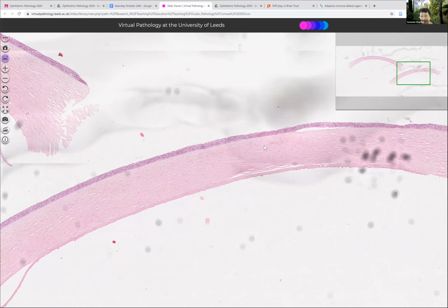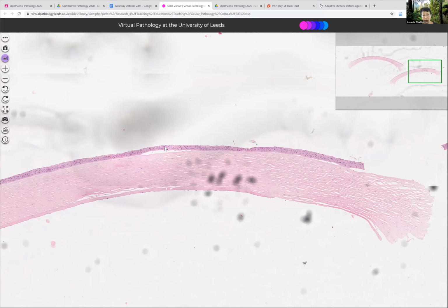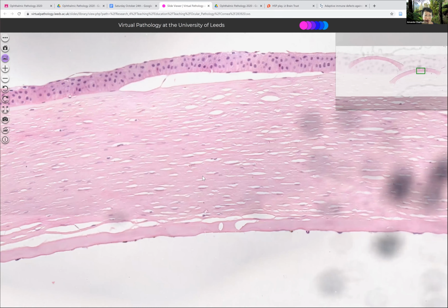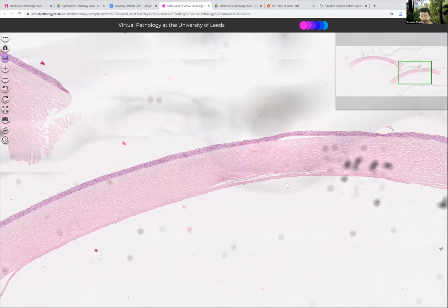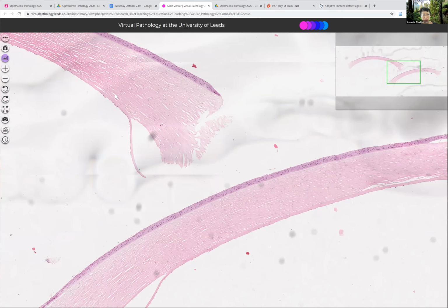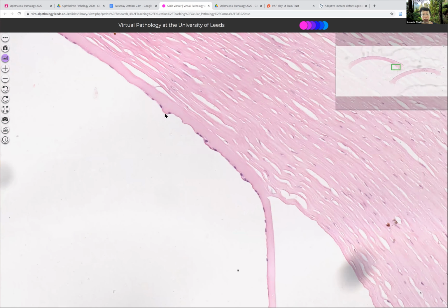And there we go. How about some bullous keratopathy happening here? So I would say Fuchs endothelial dystrophy, and the special stain that I'd like to do is PAS stain, which stains up the basement membranes a really nice dark pink color, and I'd be able to see these little excrescences better, especially if there had been regrowth, more Descemet's filling in between the guttata. Yeah, I think this is a well advanced case, so the mushrooms have kind of become humps. Incorporated.